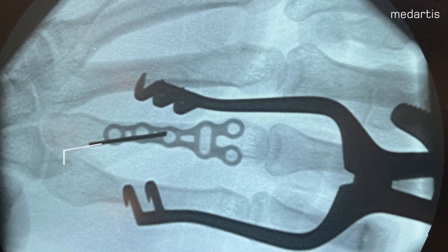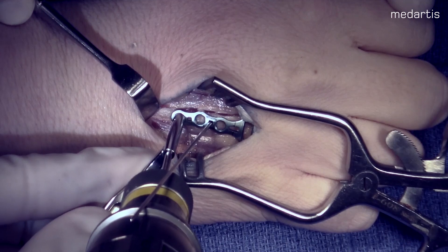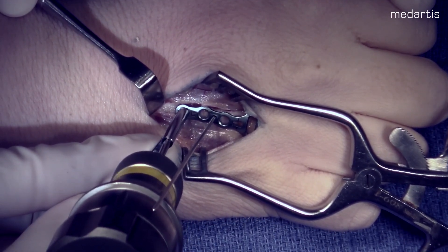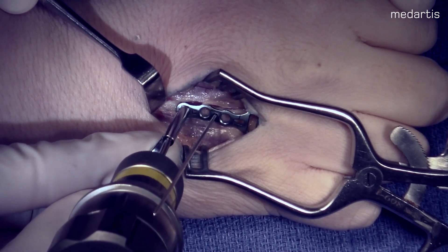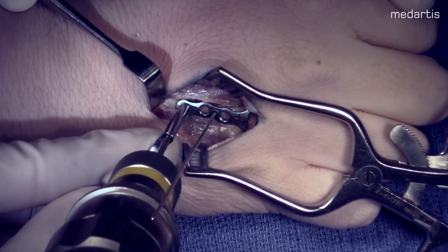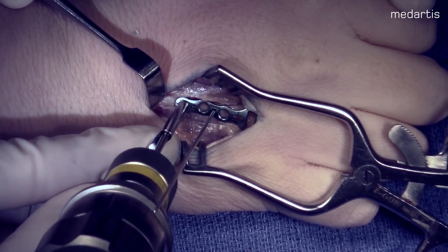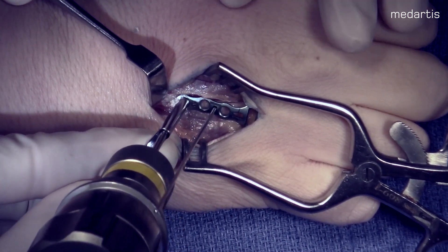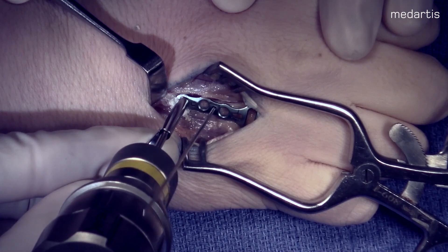After confirming the appropriate position — just proximal to the center of the metacarpal head, just short of the sagittal bands — we're next going to place our proximal screw fixation. We'll place our oblong screw and mark out our osteotomy site. After doing so, we will remove the plate, but having the pre-drilled screw positions will make it easier for the final fixation.